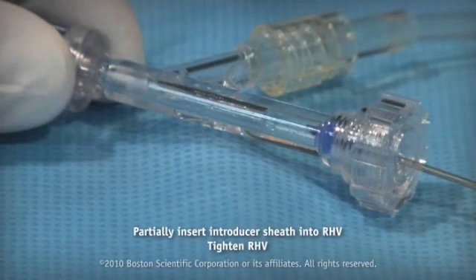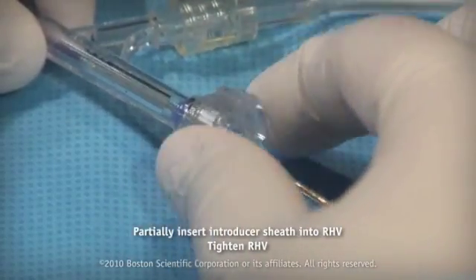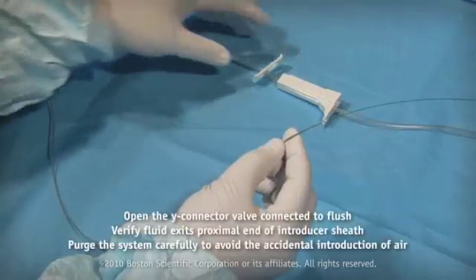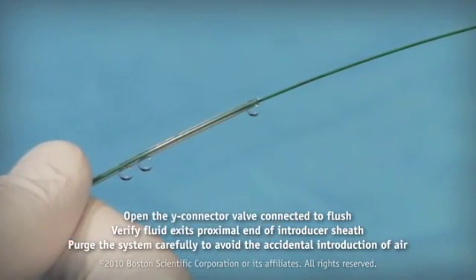Partially insert the introducer sheath into the 3.5 French compatible RHV connected to the microcatheter. Tighten the RHV. Open the Y connector valve of the RHV that is connected to the sterile heparinized saline flush. Verify the fluid exits the proximal end of the introducer sheath.